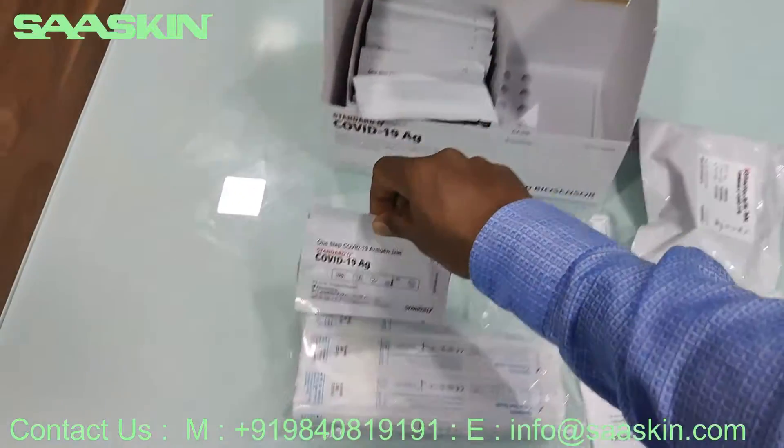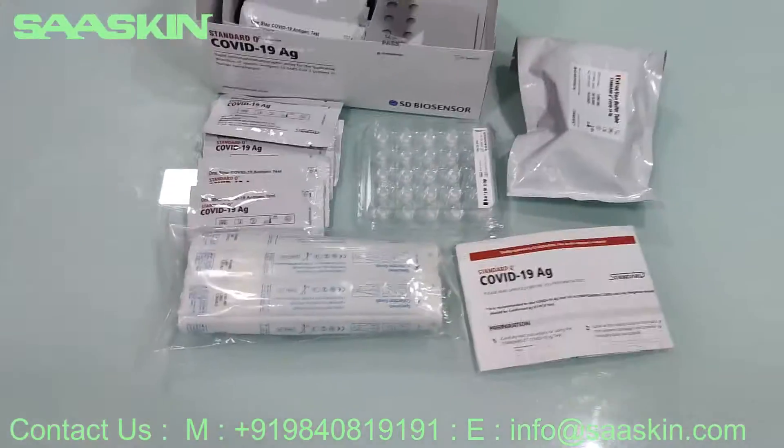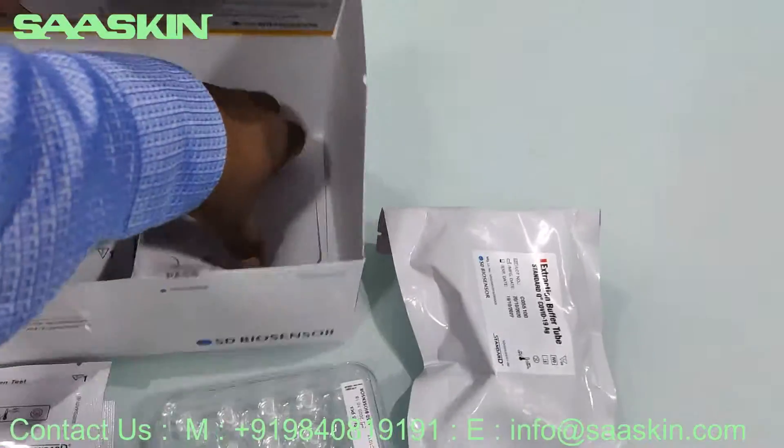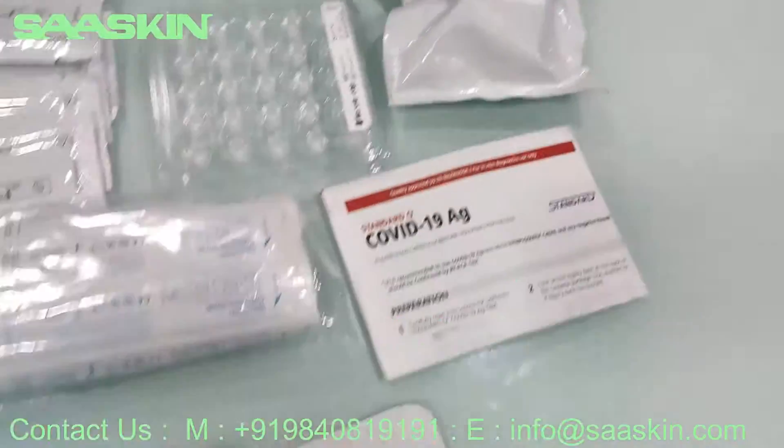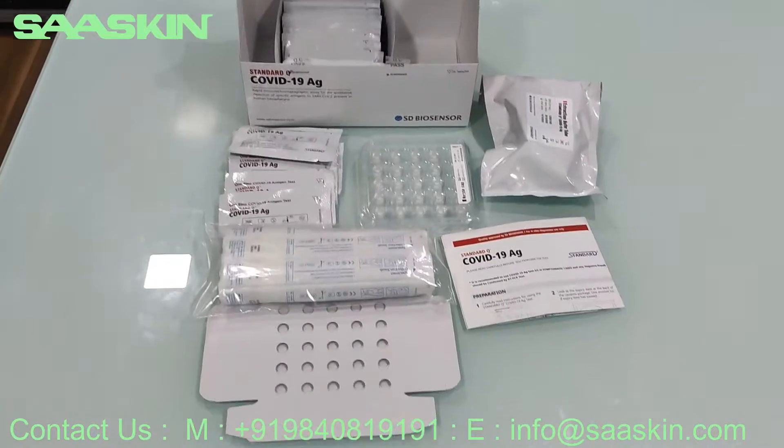Let me show you some of the test cassettes here. This is the test cassette. And you also have a paper stand. There's a paper stand included as well. Okay, this is how the total box contents look like.